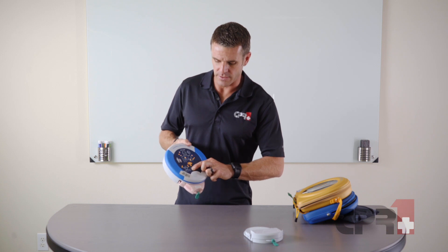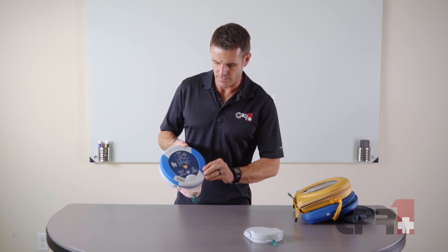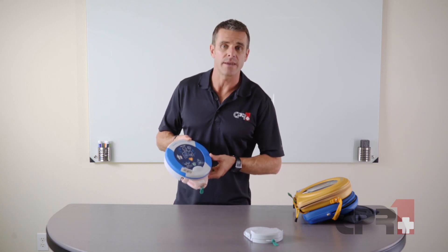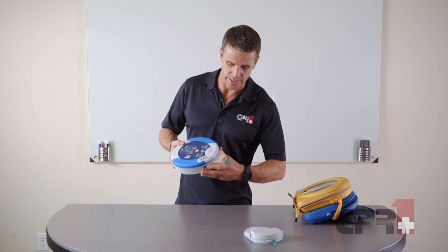Then you would just turn on the unit. It will indicate 'Child patient — call for medical assistance,' and you can see it recognizes that and goes into pediatric mode.